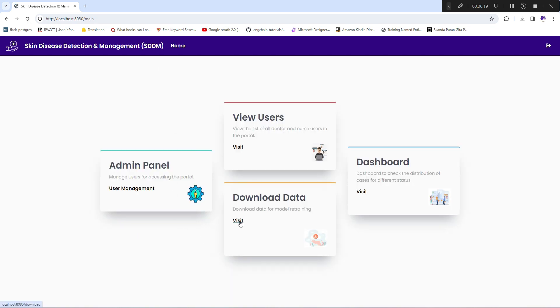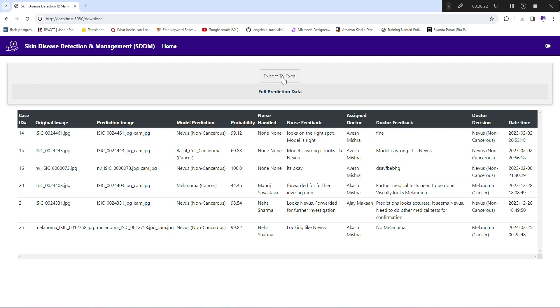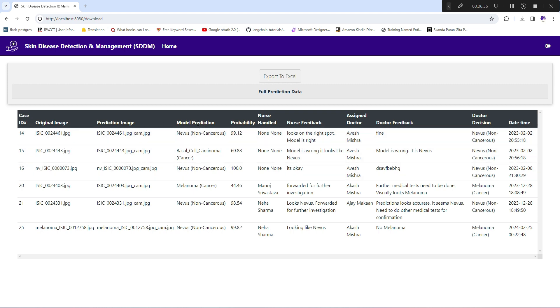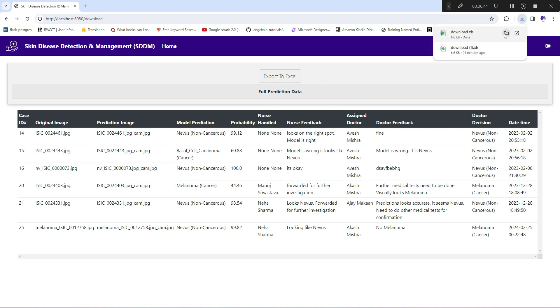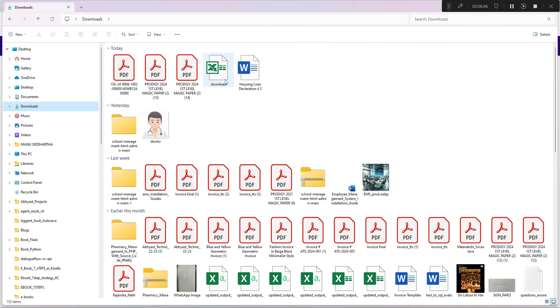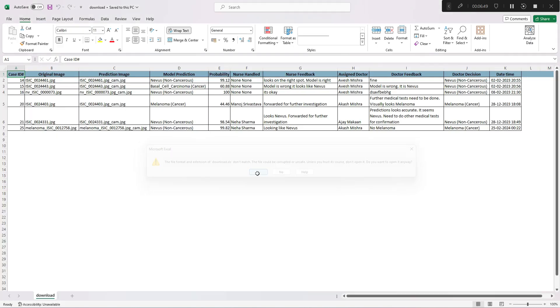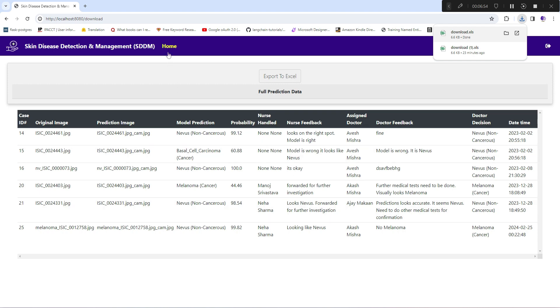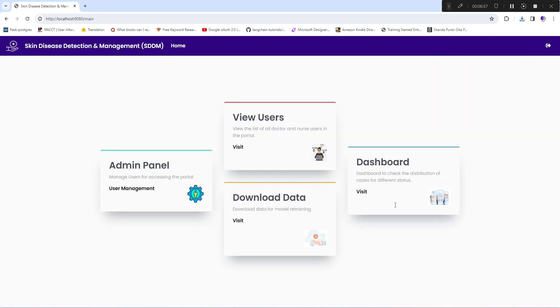With the download data option, you can see all the images: the original image and the prediction image, which is the Grad-CAM image highlighting the affected region. All data including model prediction probability is available, and you can export it directly to an Excel sheet. This completes the overall view of the admin.